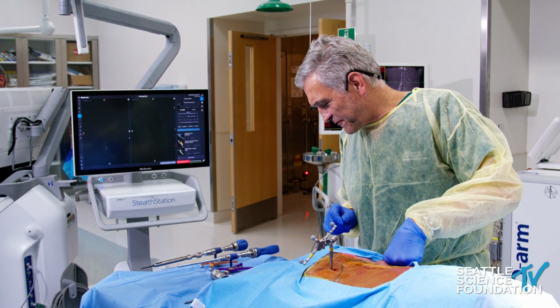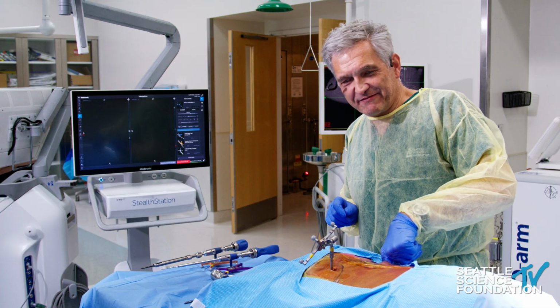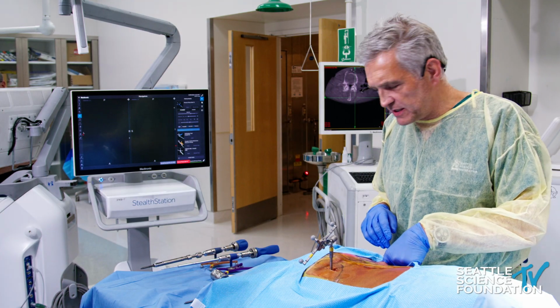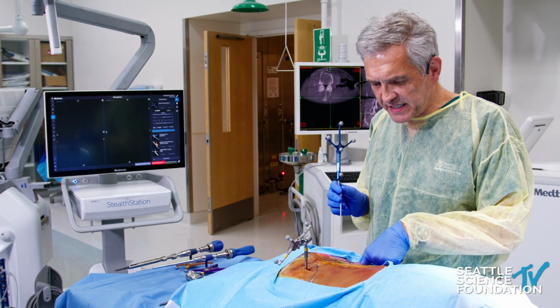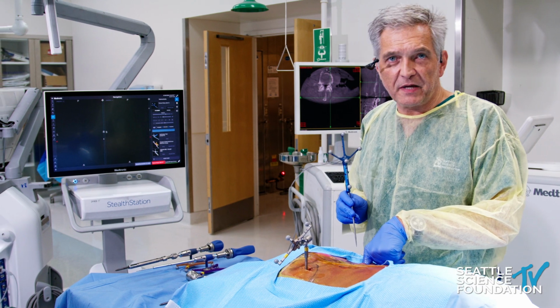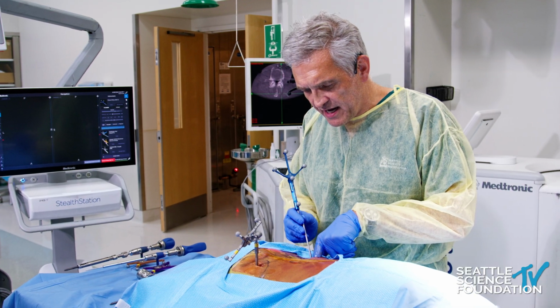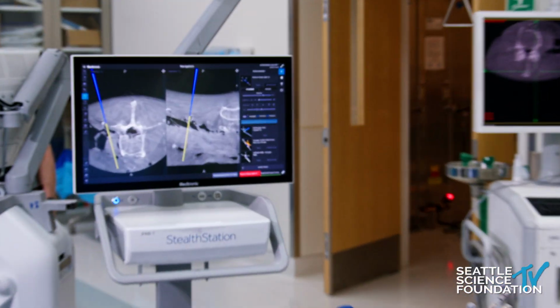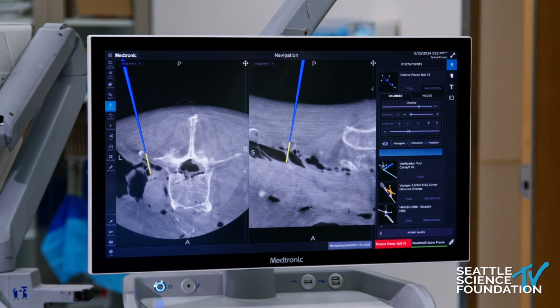So the first thing here is I want to make sure that navigation is accurate, right? With open surgery, you have the luxury of seeing all types of anatomical landmarks to confirm accuracy. With MIS, you don't have that. So the first thing I do is I do finger dissection through the muscle in the Wiltse plane down to the transverse process. And now I feel the transverse process of L3 here, and I put the pointer on the very tip of it, and I look at the screen, and you see how you have the tip there. The tip is blue? Tip's blue, yeah.